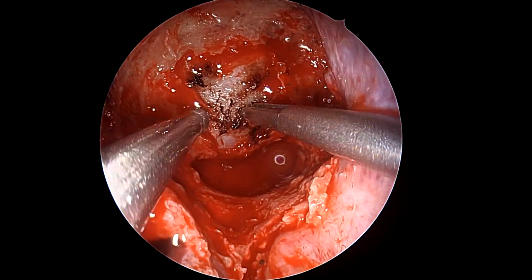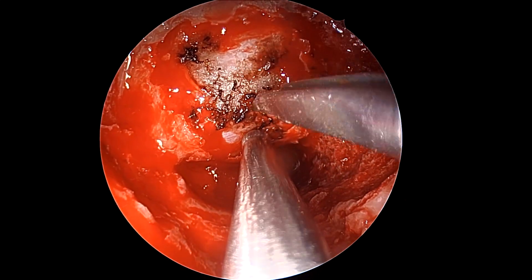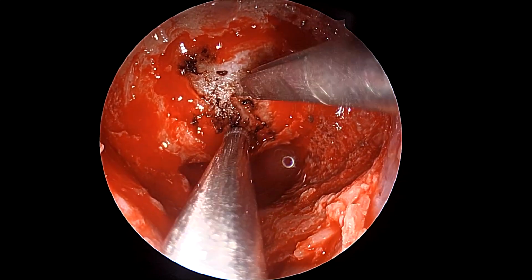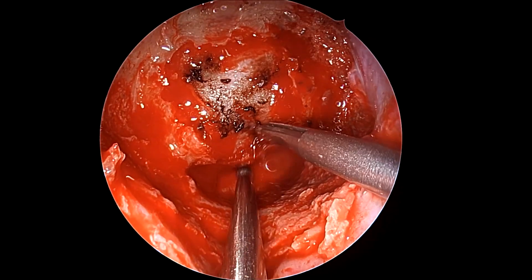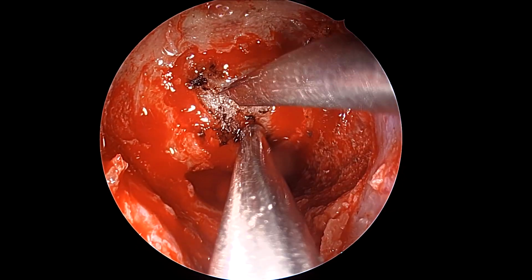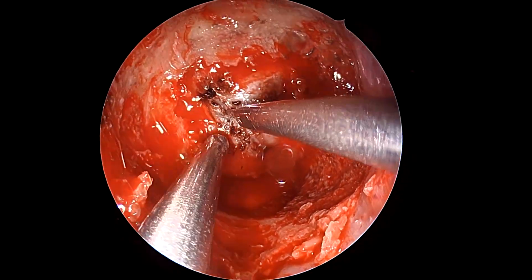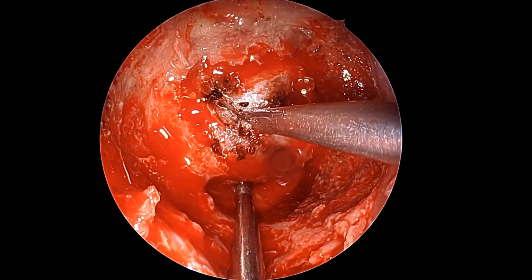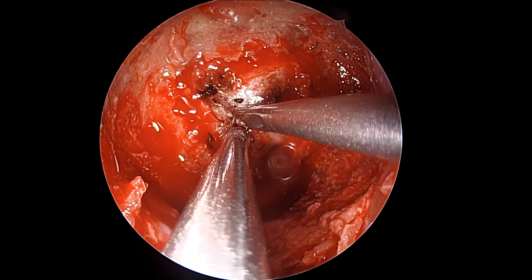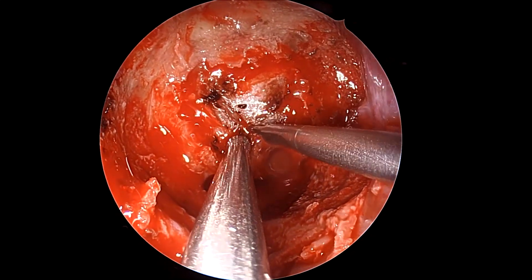Here we're using a sharp retractable sickle to open the Sellar dura in the midline vertically, followed by there will be an incision horizontally as well. And this is, well, I normally feel that this is a good trade-off when you're trying to be cautious about the vessels and the vasculature on the lateral side. You go and you keep decompressing, and in case you want, you can always increase the incision using a scissors, depending on your comfort levels.